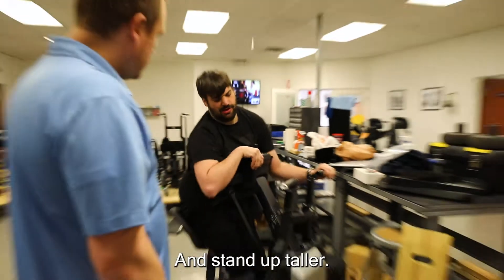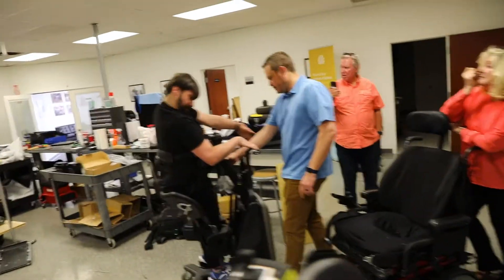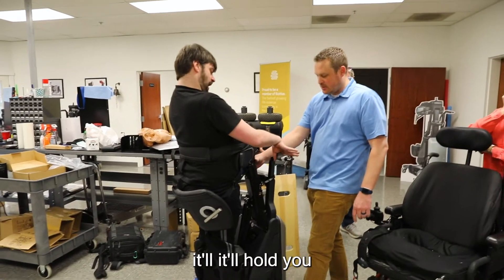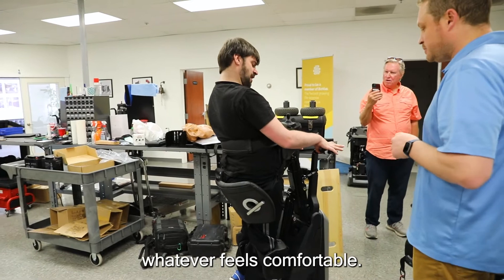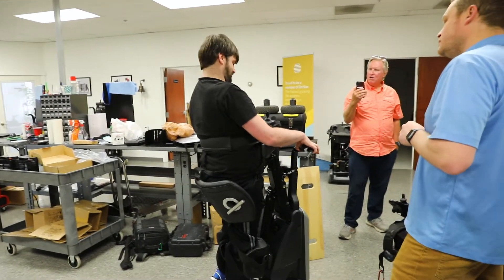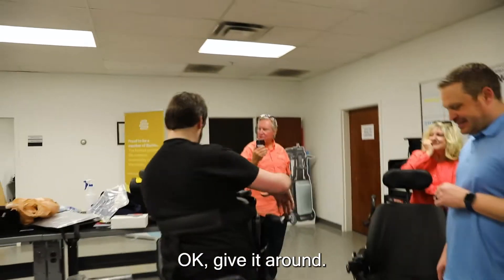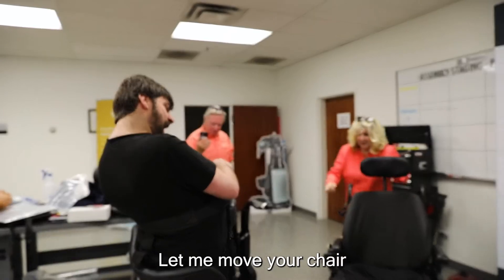Is that better or do you want to go back to your higher standing position? Stand up power — just this end. Wherever you want, let off and it'll hold you, whatever feels comfortable. That's awesome! Good. Go ahead and do a lap around the floor — let me move your chair.